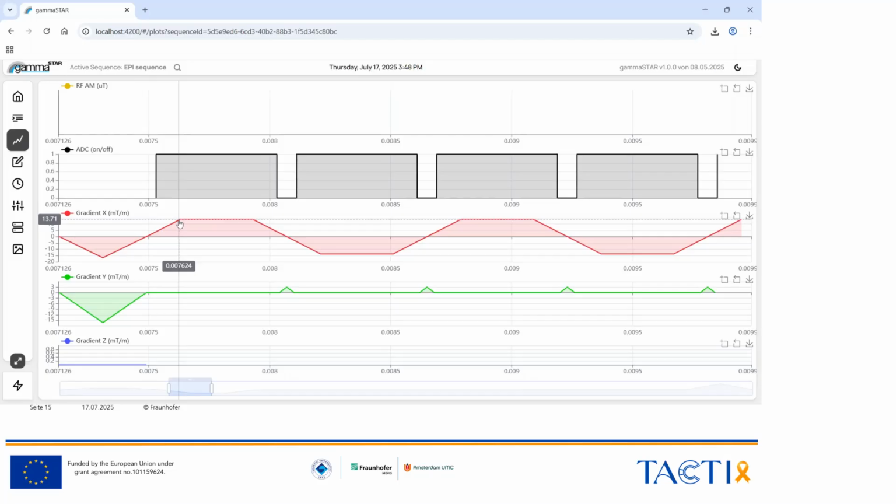We start here, we have the same sampling rate of our readout system, but we travel more slowly towards the beginning and the end, which would mean we have the ramp up phase, and then we are faster, we have the same velocity as before, and we slow down towards the end. So now we don't have equidistant sampling anymore, but we have a more dense sampling here, an equidistant sampling here, and a more dense sampling again here.